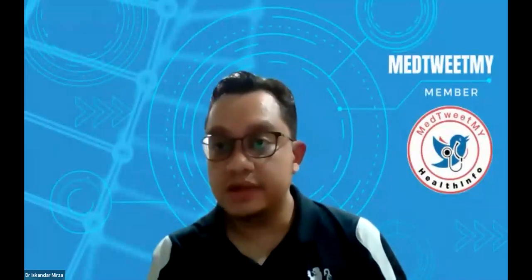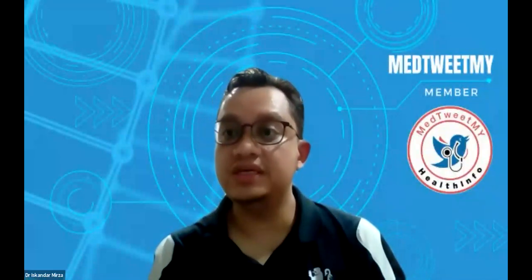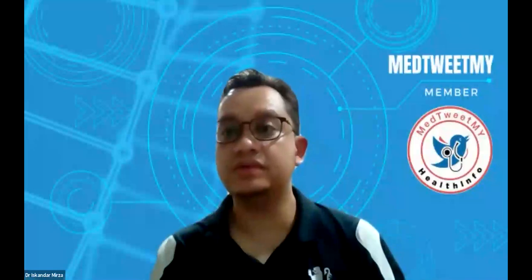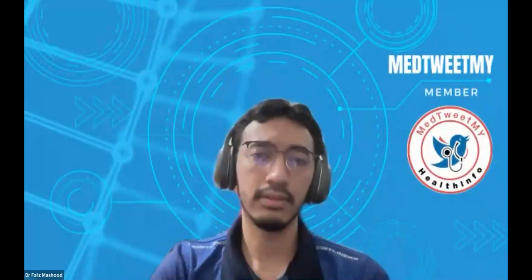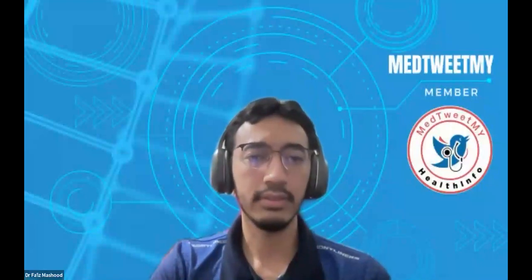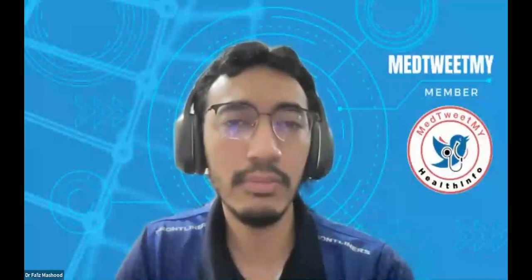Okay. Next one, Faiz, is how to know whether PVC induced on EST needs to be addressed or neglected, or not neglected lah, addressed. Okay. I think PVC is another whole topic actually. The moment the patient develops PVC, PVC can be benign, can be malignant. We need to know what's the underlying cause of the PVC.